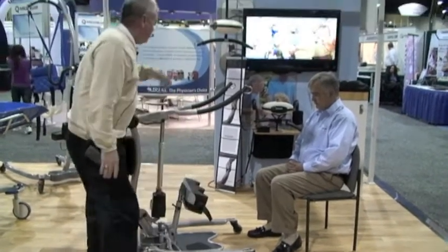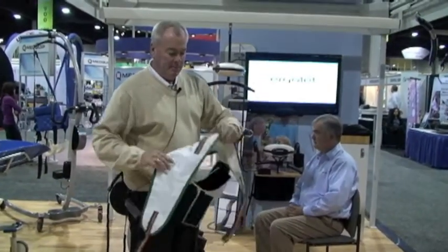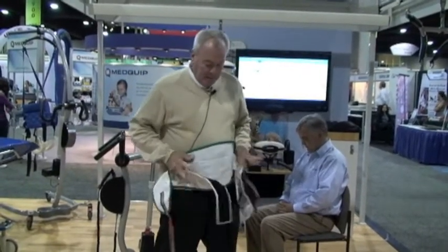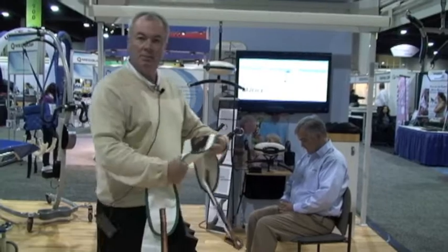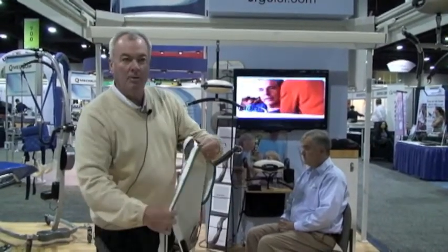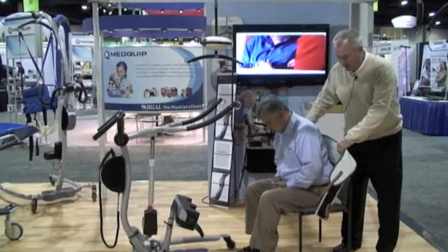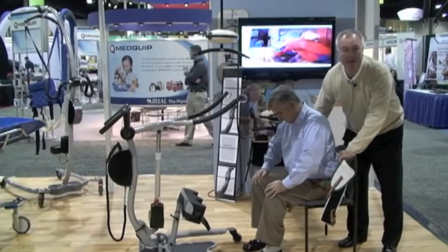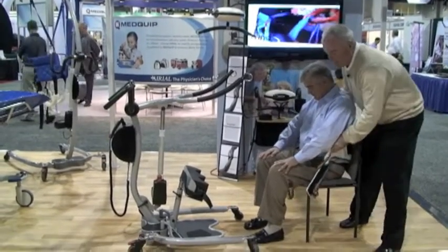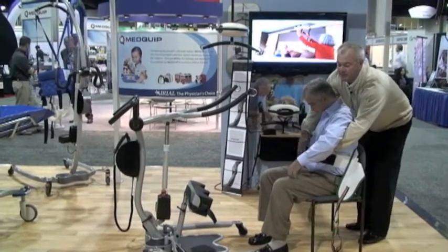I'm going to go ahead and stand this particular gentleman up. His name is Tom Kuhn and I'm going to be using one of our disposable sit-to-stand slings, which is new on the market. This is a large sling because of the color coding. I'm going to lean Tom forward and place the sling on the lower part of his back, then have him lean back while we put the belt around him.